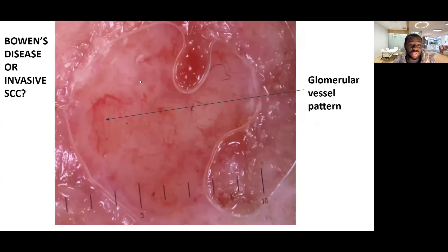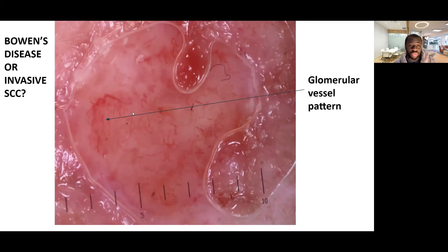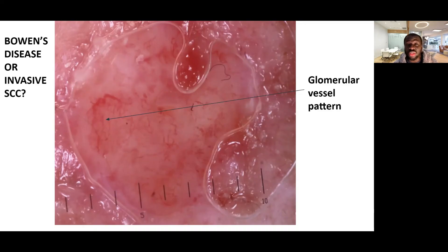Looking at this other lesion — it still looks like a Bowen's disease, but could also be a lesion that has transformed into a squamous cell carcinoma. We need to be very careful in assessing the patient and making a clinical decision. You can see these blood vessel patterns also having the circular glomerular pattern. If it's an ulcerated lesion, you'll be making a clinical diagnosis of squamous cell carcinoma; if it's non-ulcerated, you'll be thinking this is likely Bowen's disease, and you might still need to excise it for histological diagnosis.